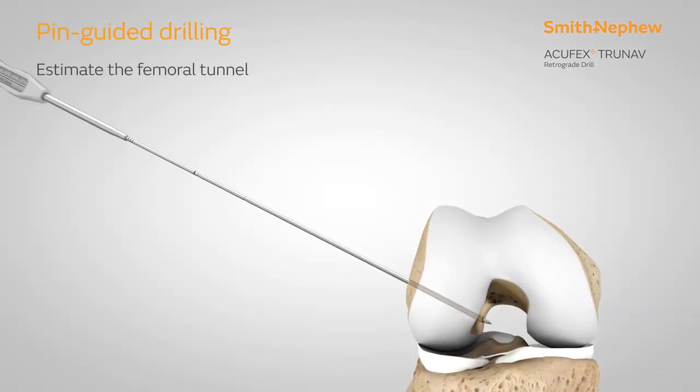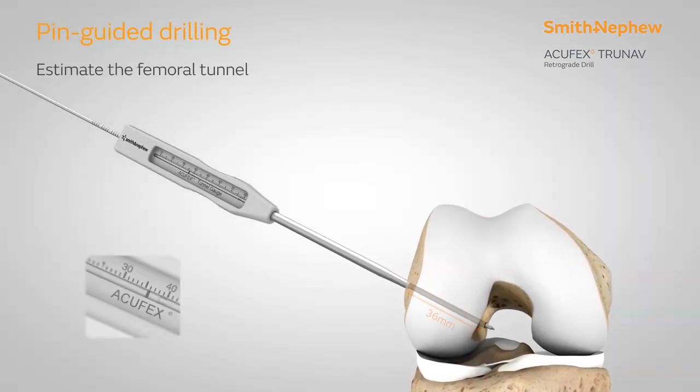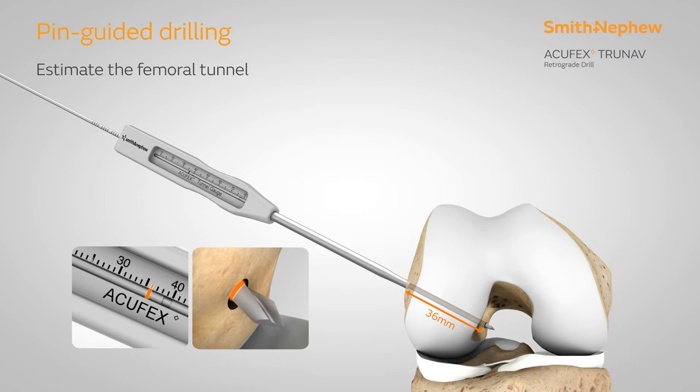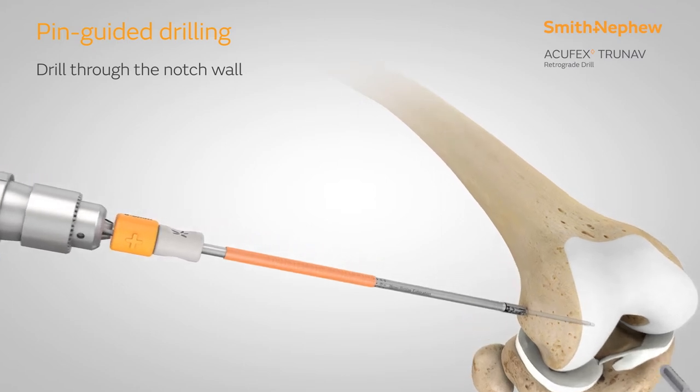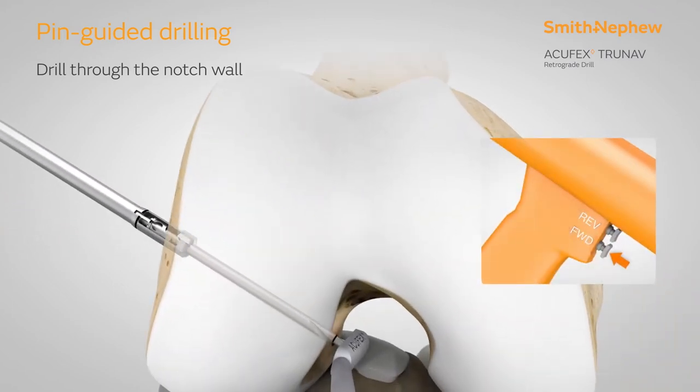Estimate the full femoral tunnel length using the Acufex Tunnel Gauge and the laser line at the midpoint of the guide wire. Use the pin-guided accuracy to anterograde drill through the notch wall. A curette may be used in the notch to capture the guide wire.